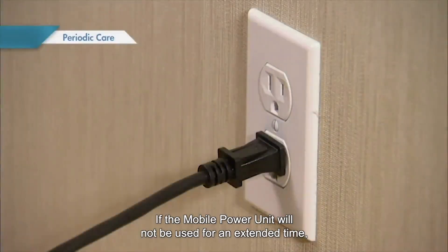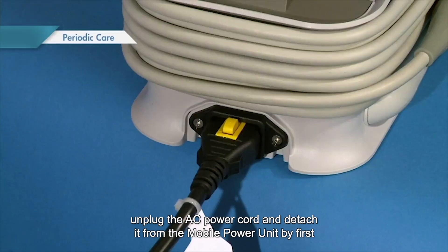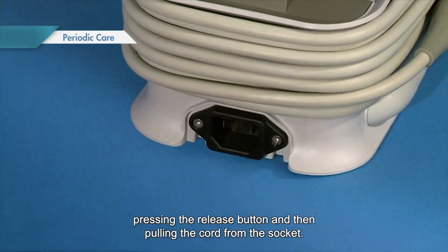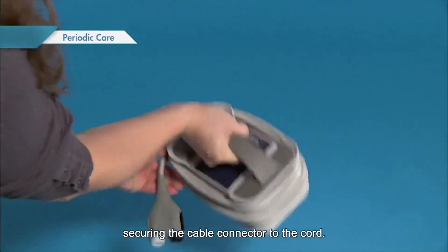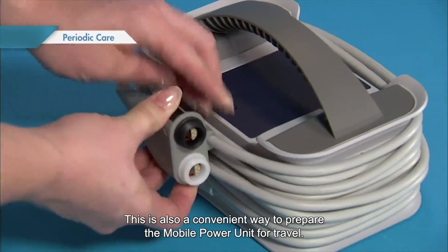If the mobile power unit will not be used for an extended time, unplug the AC power cord and detach it from the mobile power unit by first pressing the release button and then pulling the cord from the socket. Wrap the patient cable around the mobile power unit for storage, securing the cable connector to the cord. This is also a convenient way to prepare the mobile power unit for travel.